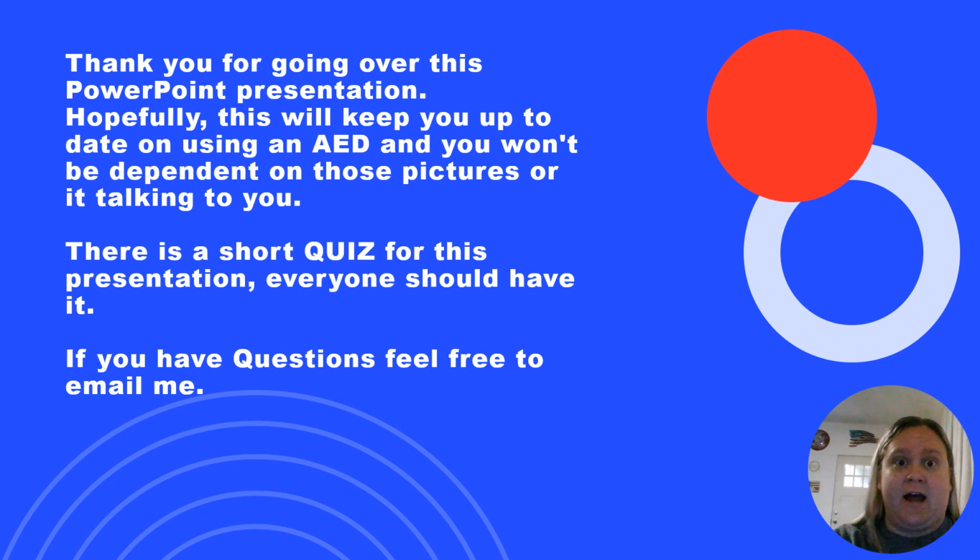All right, so that is pretty much it. The AED refresher course, it's pretty easy and cut and dry. I mean, like I said, they're easy to use. I just put this presentation together in hopes that we can potentially get out of the habit of being dependent on those pictures, and the fact that it talks to you makes things run smoother.